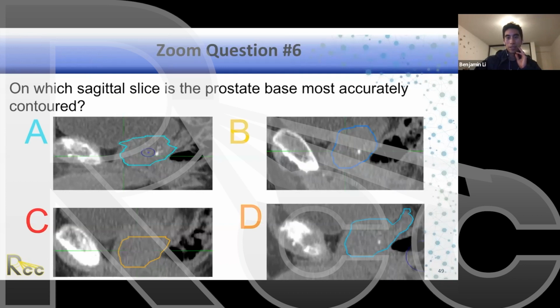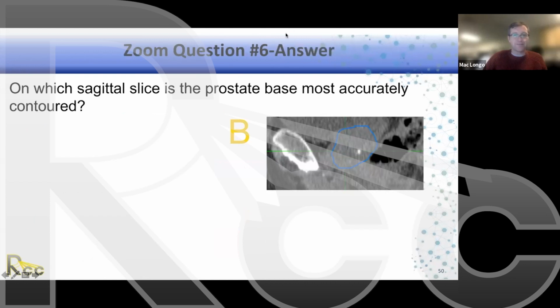Okay, good. Take some time to put in your responses. Okay, we'll give maybe 5 more seconds. If you're not sure, it's okay to make an educated guess. 3, 2, 1. Okay, and here are the group results. Great. And B is the winner, everybody.